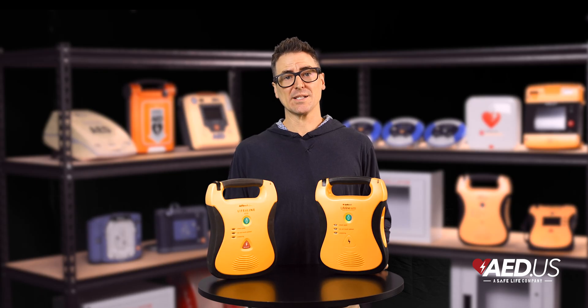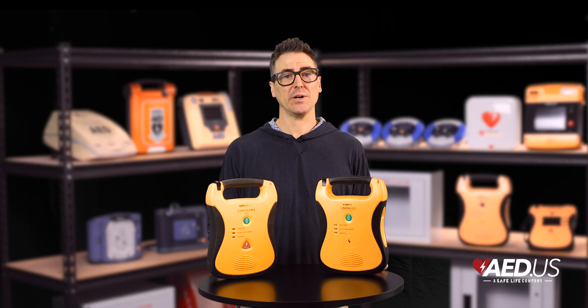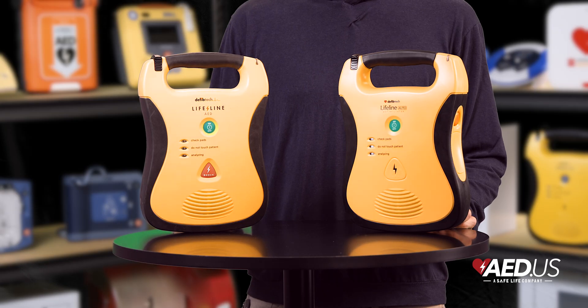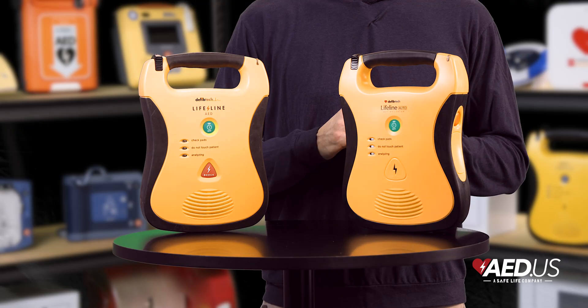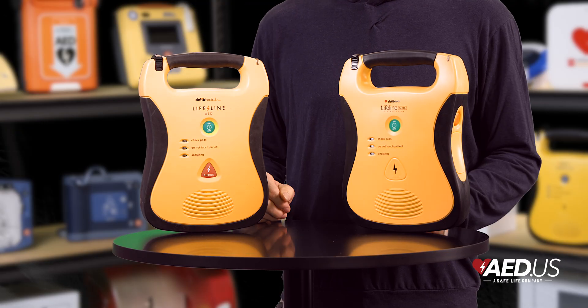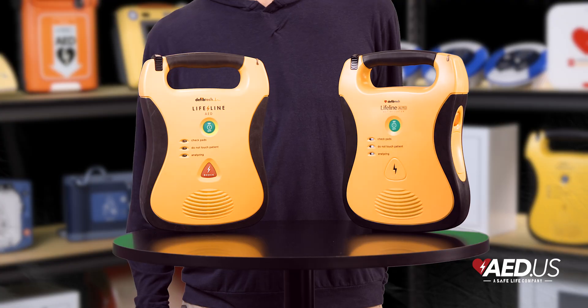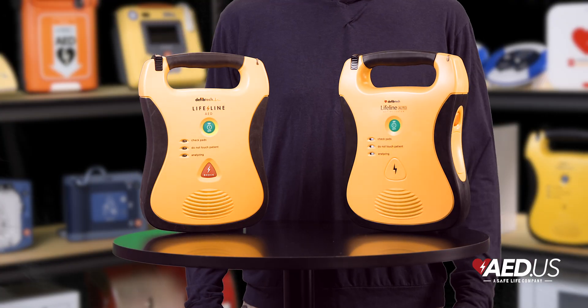The Lifeline AED is designed for low maintenance, performing daily self-checks to ensure battery, pads, and internal electronics are operational. A visible status indicator lets you know at a glance that your device is rescue-ready. With minimal upkeep required, the Lifeline AED is an easy and reliable choice for any organization.